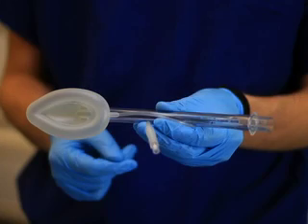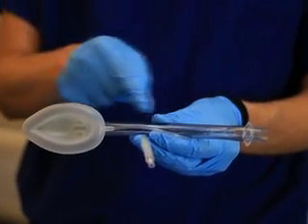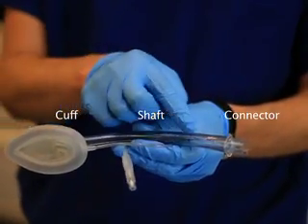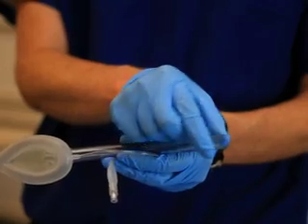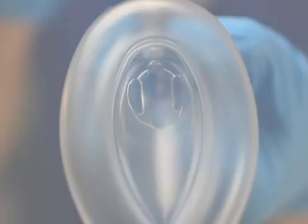An adult-sized laryngeal mask airway is a flexible breathing tube of approximately 25 centimeters in length with an inflatable bladder or cuff on its distal end. The proximal end has a standard 15 mm connector that allows attachment to any ventilation system. Air exchange occurs through the aperture on the distal end of the tube.